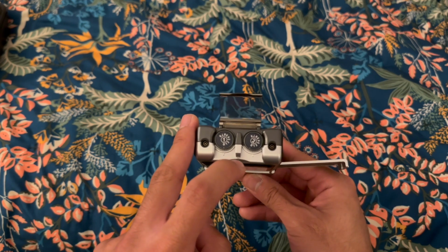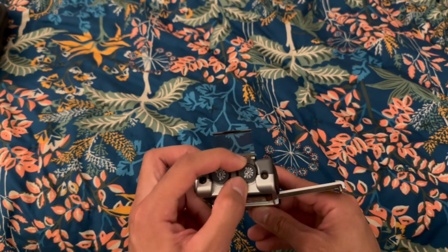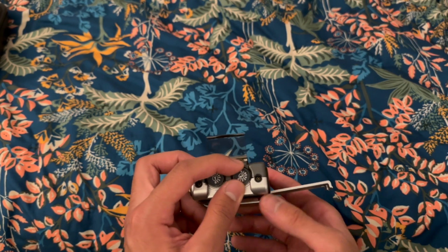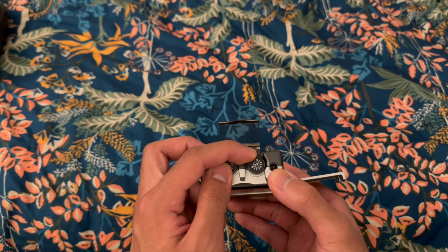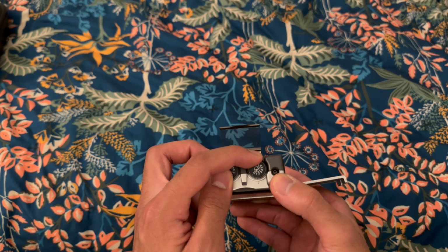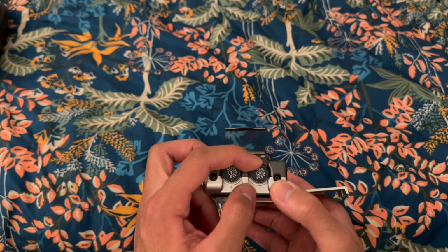And I almost forgot to touch on the intensity dial. This intensity dial is patient dependent on how much intensity they want to handle for electrical stimulation. They can send themselves a lot more electrical stimulation to be stronger, or they can send weaker electrical stimulations towards the electropads placed on their treatment area.